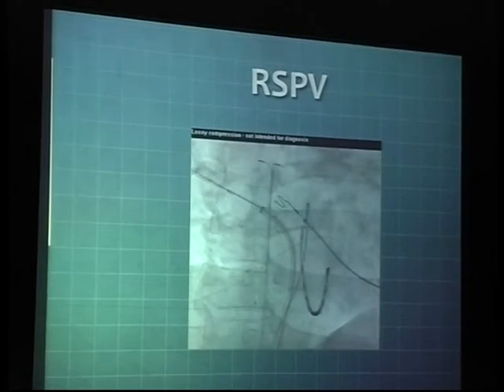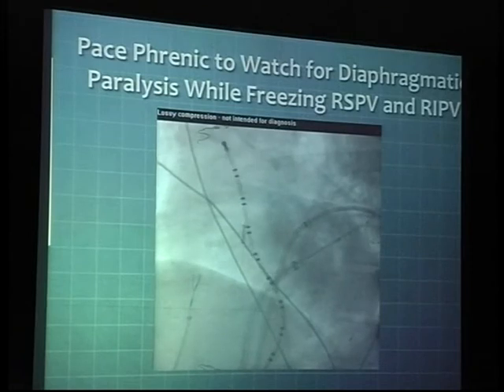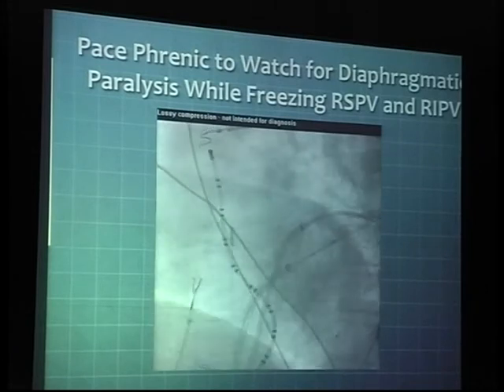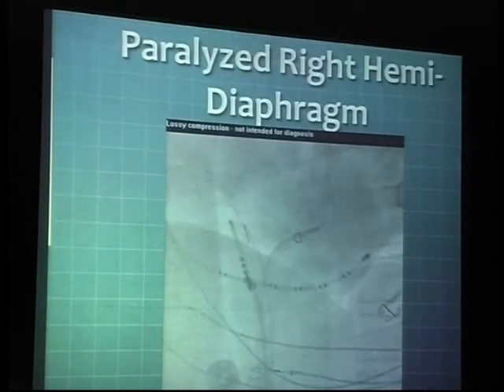This is the right superior pulmonary vein — there is contrast going through and you don't really see much of any leak around it, a sign of good occlusion. This was a case where diaphragmatic paralysis actually happened, and you're able to see the paradoxical motion of the diaphragm as it moves across against the rest of the chest cavity. That can potentially happen in these cases if proper attention is not paid, and if you don't make an attempt to really stimulate the phrenic nerve on the right side when ablating the right superior pulmonary vein.